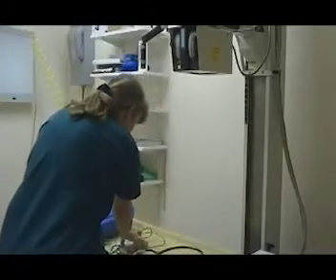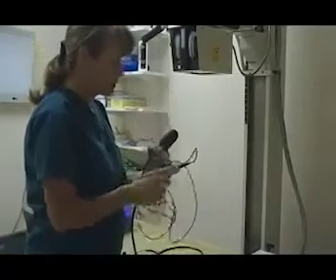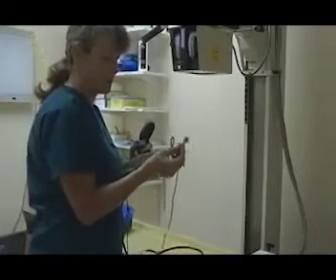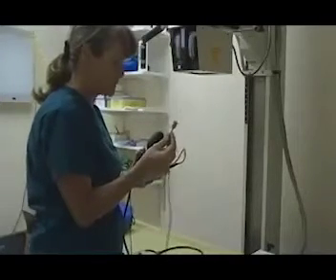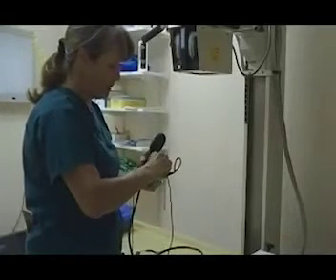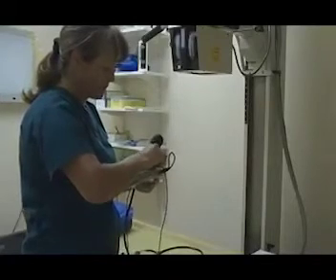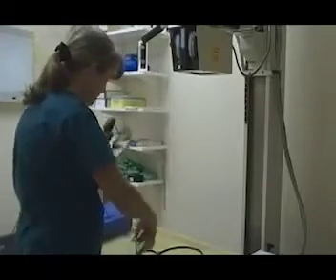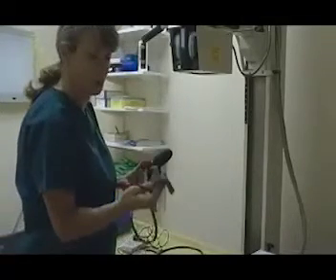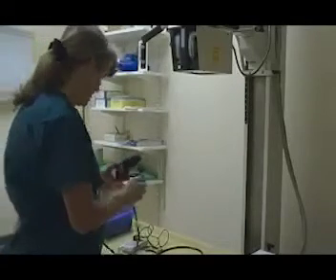The Doppler is used to monitor the blood pressure. It has a very sensitive crystal that is located in the tip of it here, that is placed on the pedal artery. That's used with the gel and then a vet wrap to secure it in place on the animal, and then the cuff which goes around the leg just above the placement of the crystal.